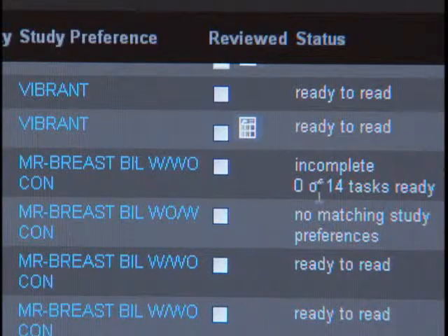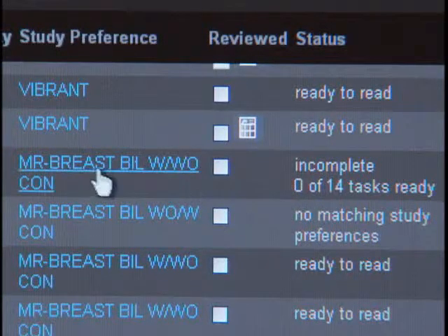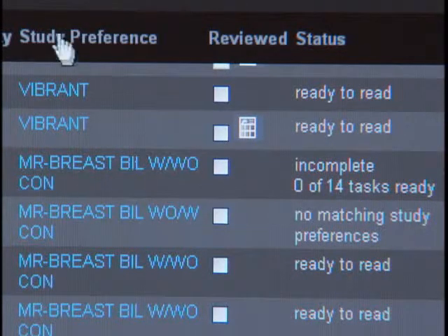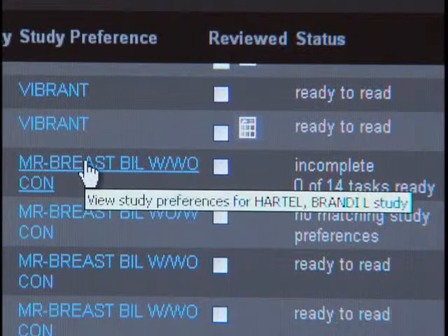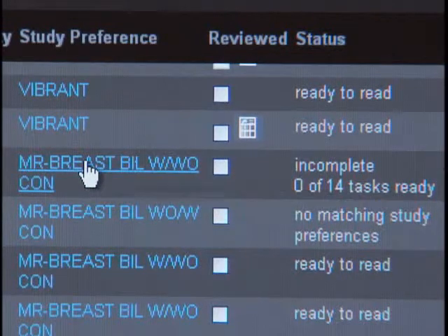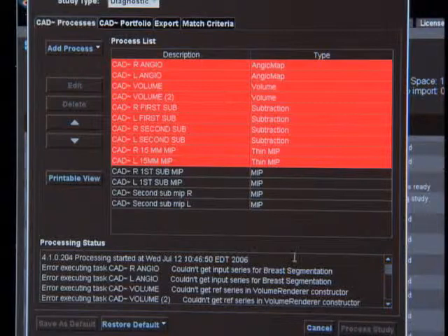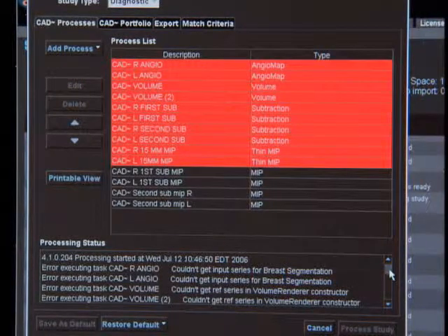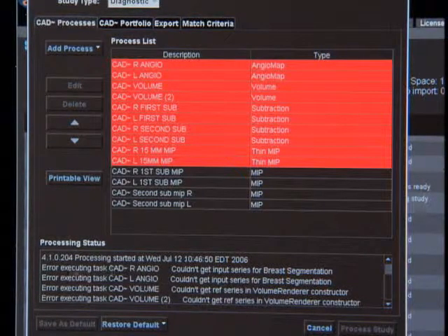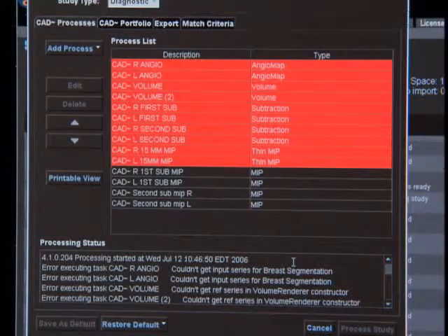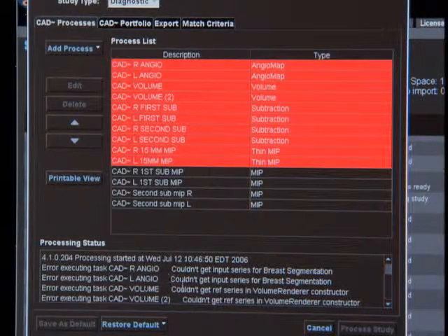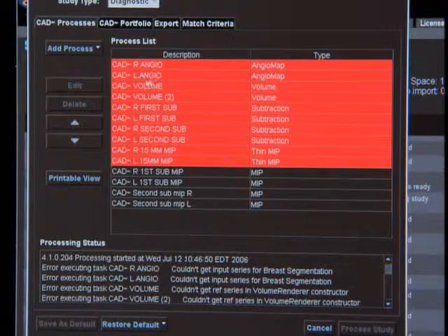One thing that can help you: if you go under the study preference and click on the study preference, this will open up a window. As you call your application specialist, if you can tell them the errors that are at the top of this list, this can help them to quickly deal with your problem and address it.